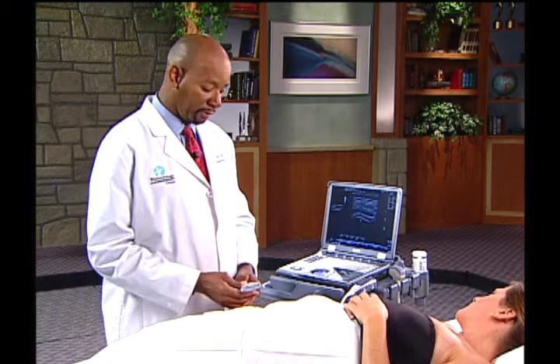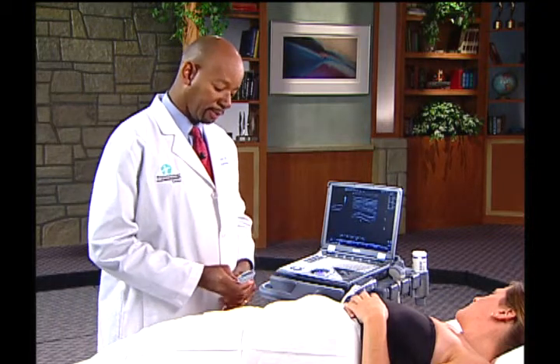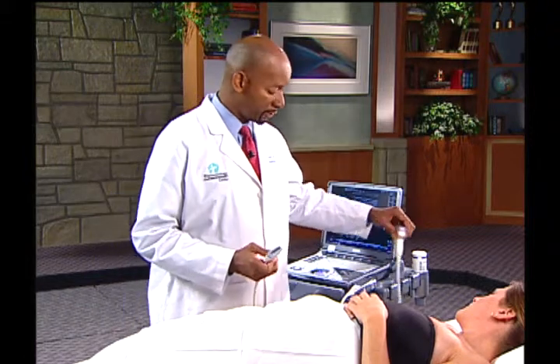So now that we have completed the evaluation of the hip, I would like to discuss with you the difference in using the different transducers. For the first two portions, I used the 4C, which is a curved probe. This is a lower frequency probe and is able to pick up deeper structures. For example, if you have heavier patients, you want to evaluate deep structures of the hip and other structures as well. The 12L, a linear probe, is actually ideal for picking up more superficial structures.